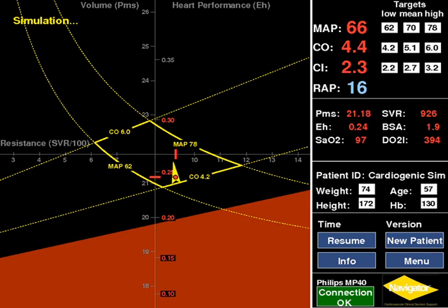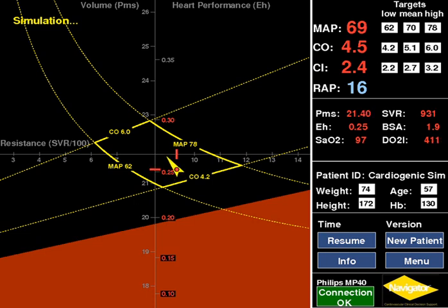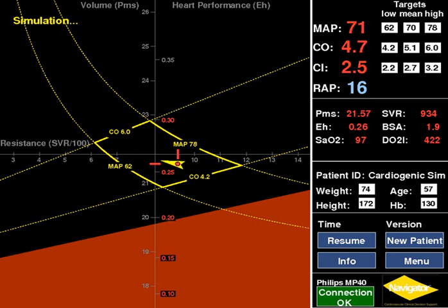A dobutamine infusion was commenced. The patient's status demonstrates improvement in cardiac performance with the addition of dobutamine and moved to the PTZ with corresponding improvements to MAP and CO. Whilst the dobutamine is titrated, I will discuss factors that need consideration when red numbers appear on the heart performance EH scale.